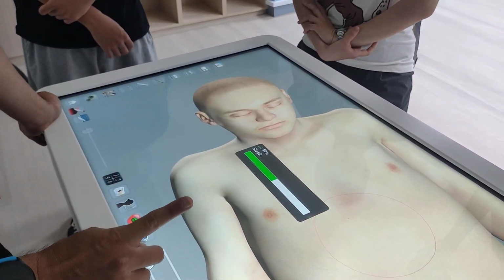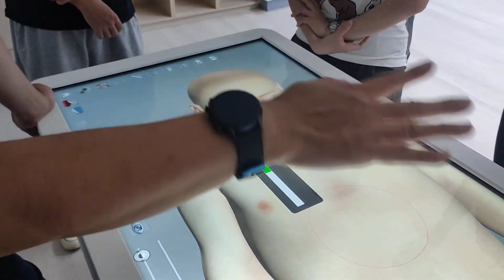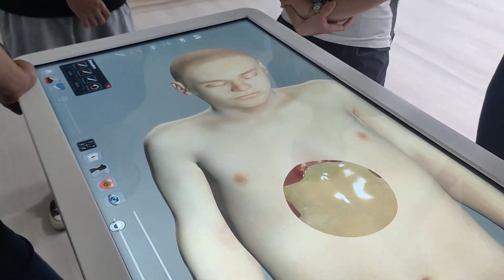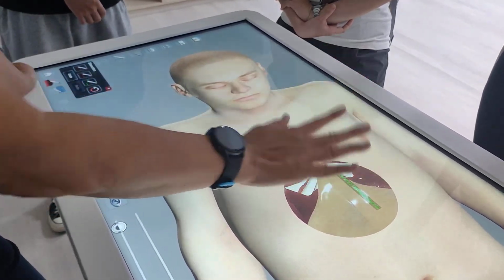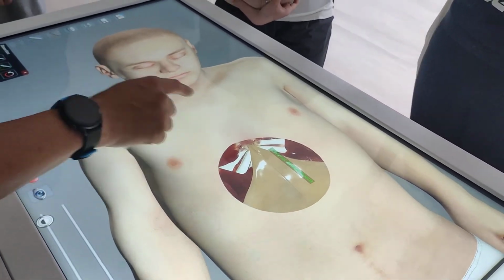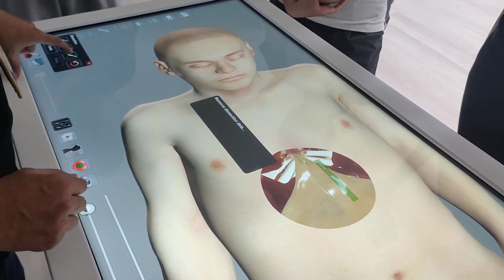This is the first step, and then if you touch again, you can remove the tissue underneath the skin, layer by layer. 也就是说，我刚摸第一下就是把它皮肤拿掉，第二下、第三下拿去之后，就一层一层剥下去。Right? Understand? Understood? Yeah.